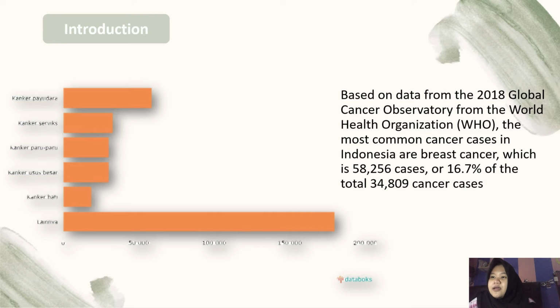This is supported by statistics from the American Cancer Society, which shows that this disease is ranked first with the highest number of cases of all types of malignant tumors worldwide. Conducting early detection of breast cancer is good early prevention, one of them by breast screening or mammography, which can find out whether there is a growing tumor, so that from the result of the examination, early diagnosis and treatment can be found. What is a mammogram? A mammogram is an X-ray picture of the breast.